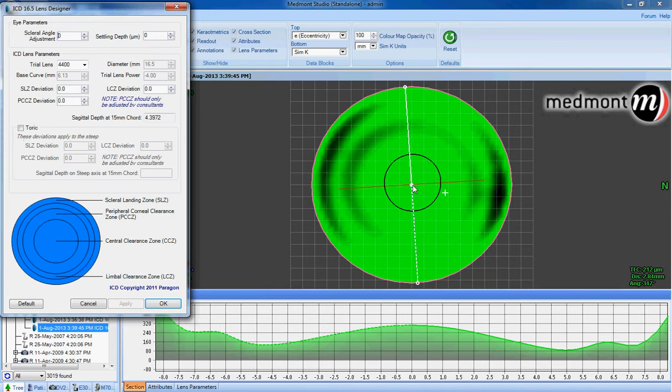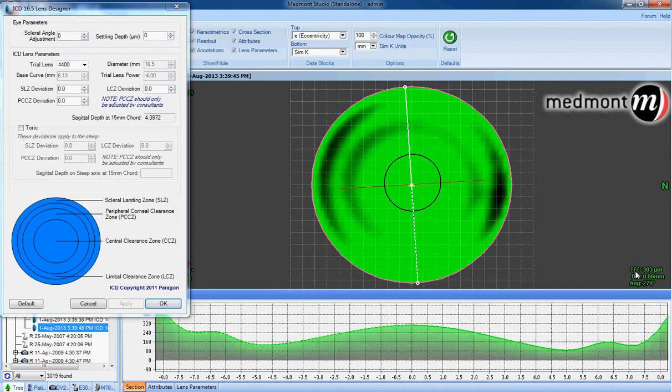Click your cursor in the center and measure the TFC or tear film clearance. This is the amount of fluid that's predicted to be between the back surface of your scleral lens and the surface of the eye—in this case, 303 microns.